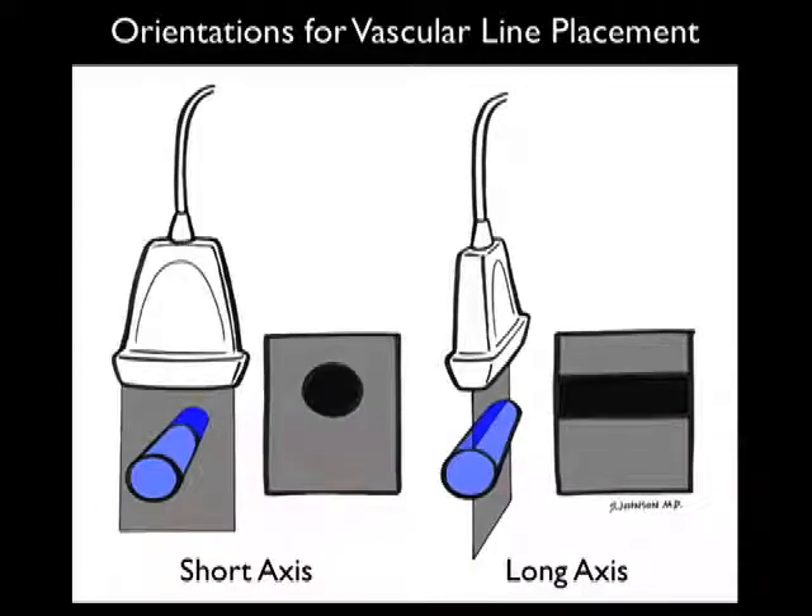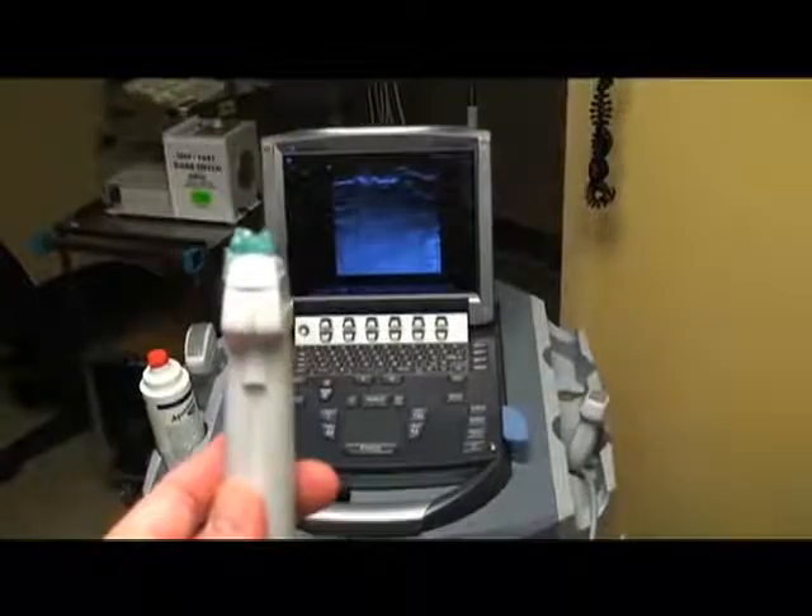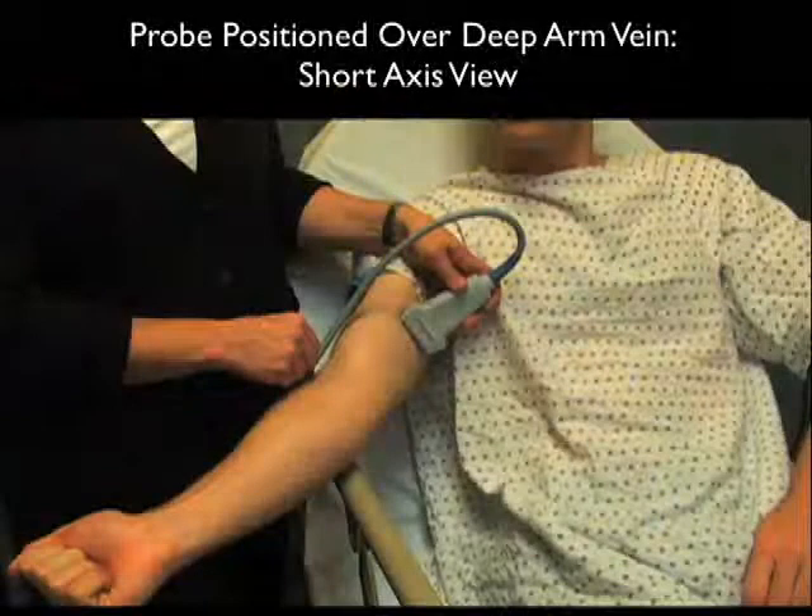Here are the orientations in which we can place the probe to inspect a vein for vascular line placement. In the short axis view to the left, we're placing the probe perpendicular to the vein, and the resulting ultrasound image of the vein will appear as a circle, as the vascular structure is cut end-on. In the long axis view to the right, the probe is placed longitudinally along the course of the vein, and the resulting image appears as a tubular structure on the ultrasound screen. Here's the high frequency linear array probe we'll be using for vascular access, with the indicator marker on the side of the probe.